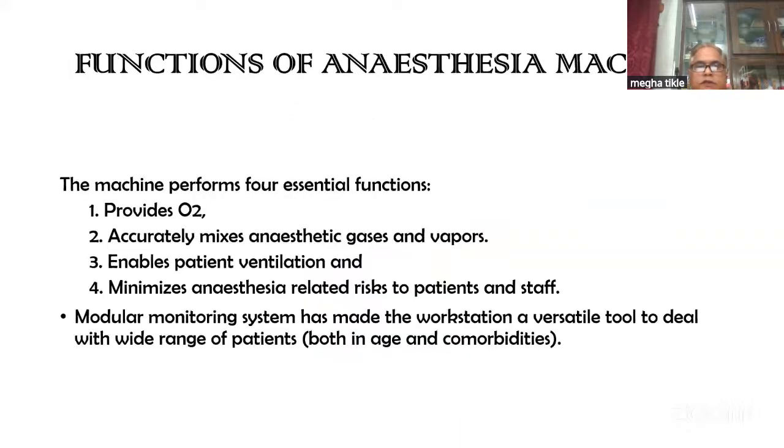Now, what are the functions of this machine? Well, it has only four functions: provide oxygen, accurately mix anesthetic gases and vapor, enable patient ventilation, and minimize the risk to patients and staff.